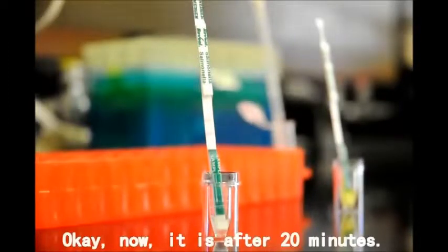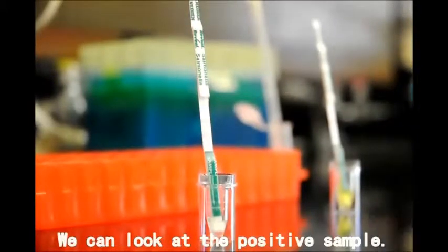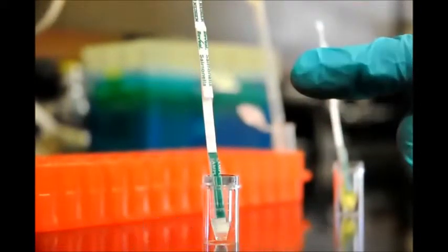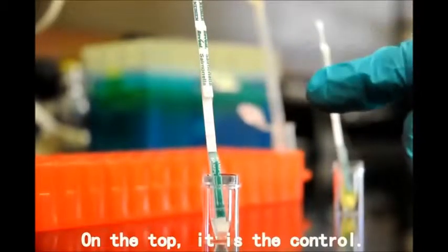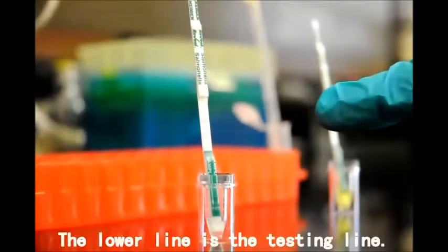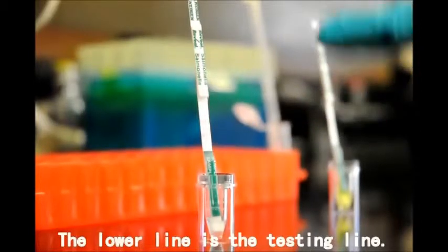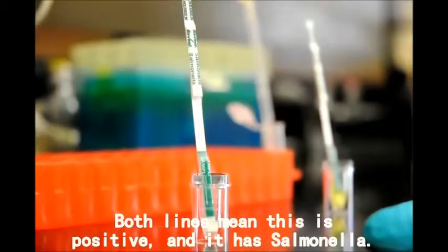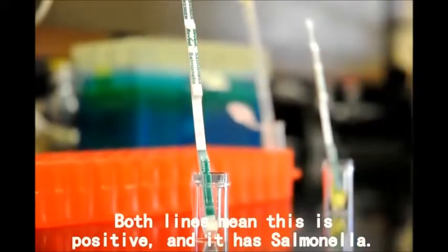Now it's after 20 minutes. We can look at the positive sample. You can see on the top you have two lines — the top is the control line and the lower line is the test line. Since both lines appear, that means this is positive. It has salmonella.